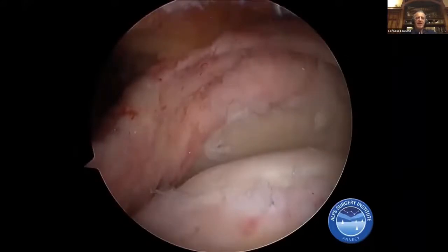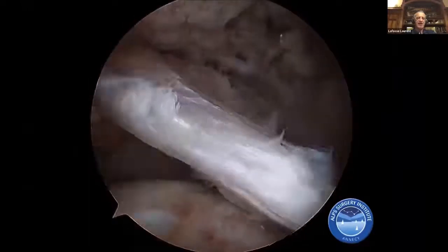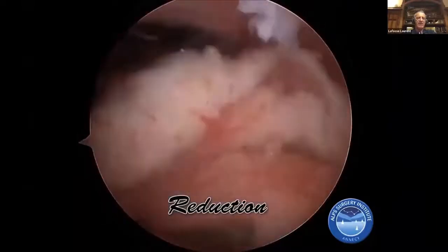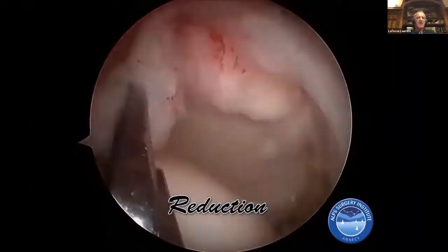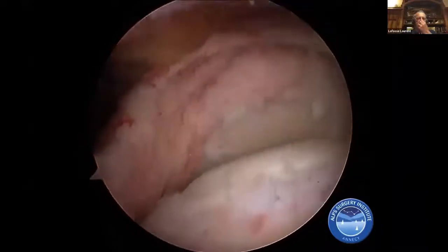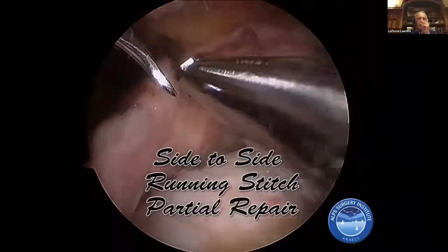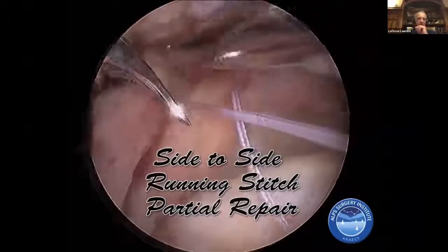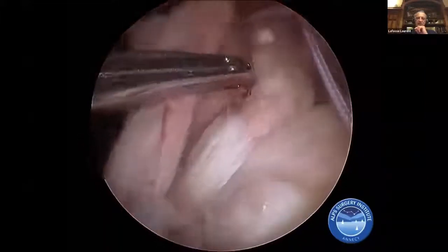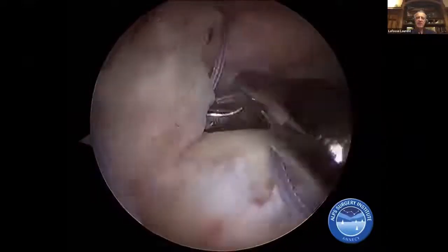This is a massive tear, and it's like what Saeed showed you before. It's a side-to-side, but without anchor. So this is the anterior layer. It's a V shape, and very often you have a V shape, and you can even have a double layer here. But you see the quality of the tendon does not allow you to come back to the tuberosity and to make it work. So what I did is that I took one suture, only one. It must be a good suture, because if you take a bad suture, it's not going to work well. But here you see, you take both layers. This is the deep layer, and I will manage to make a lasso loop on the deep layer here.